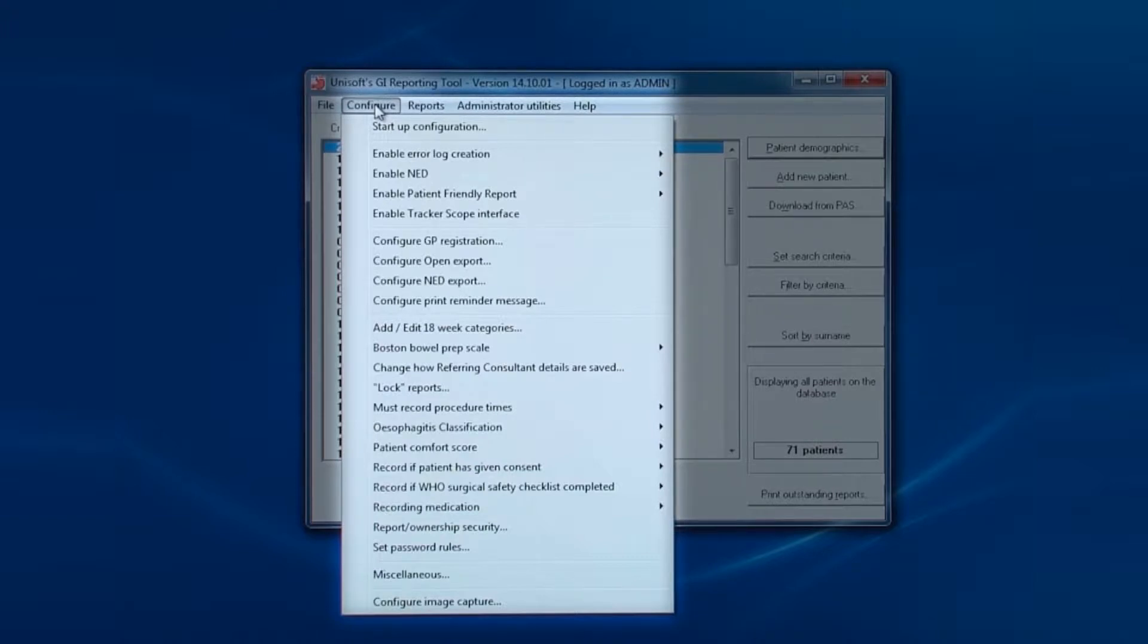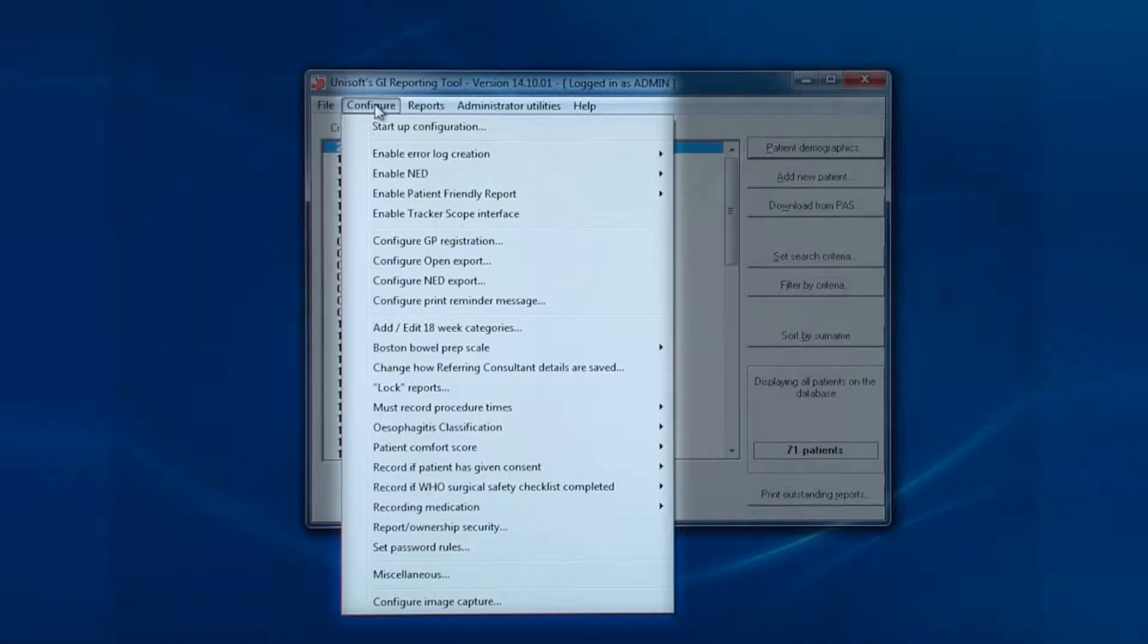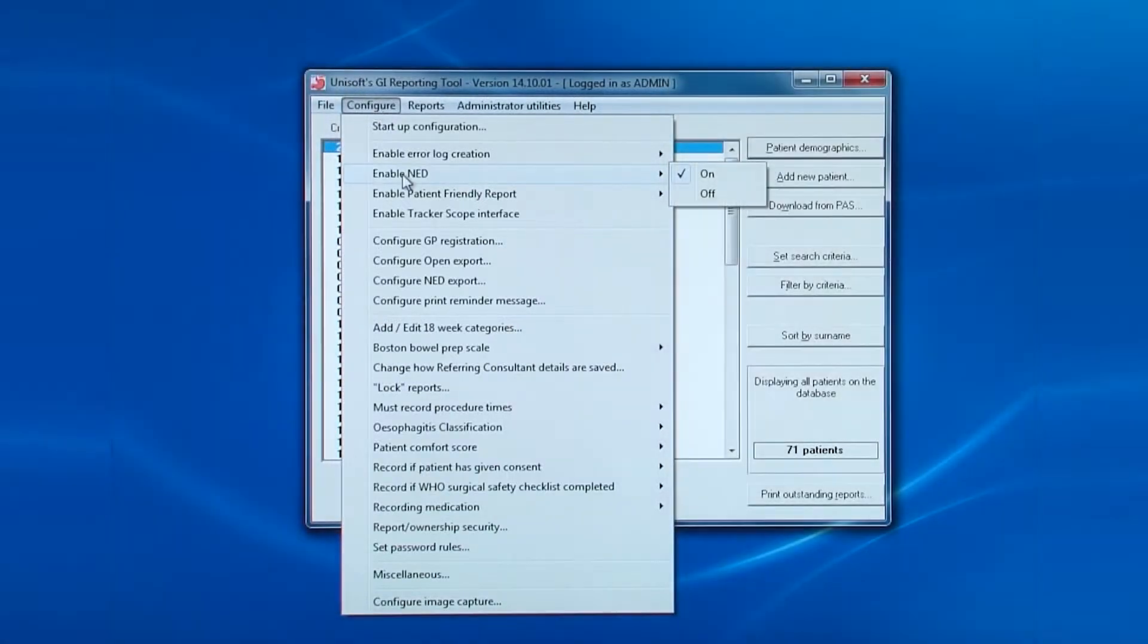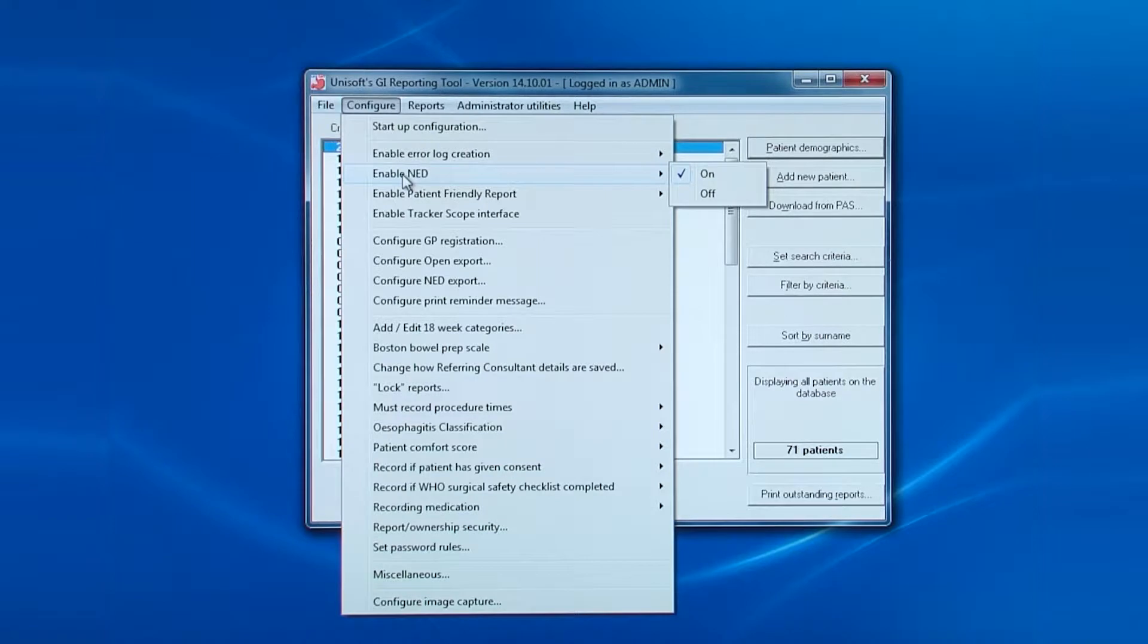You can see in the first two sections how different functions can be enabled and configured. Then there are a series of options that change how the software operates and which options need to be switched on. UNISOF will have taken admin through these various options when the software was first installed.